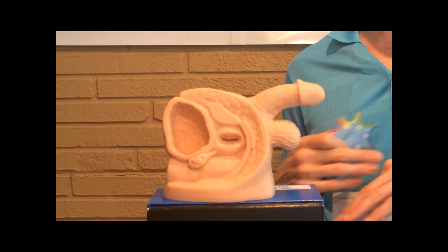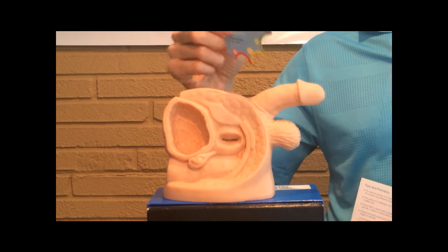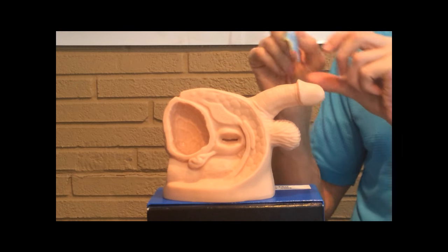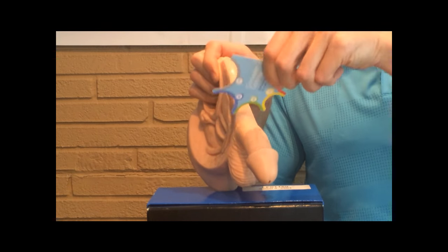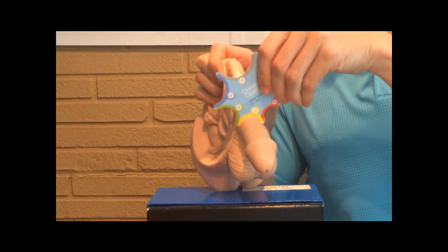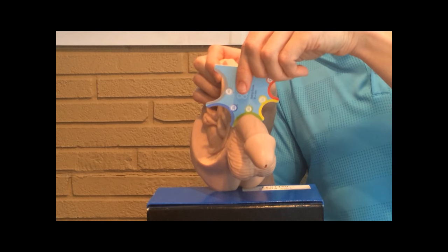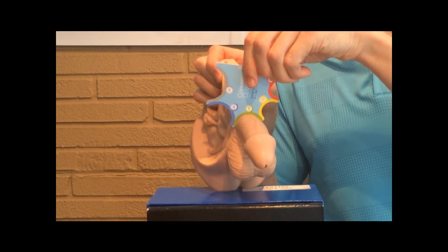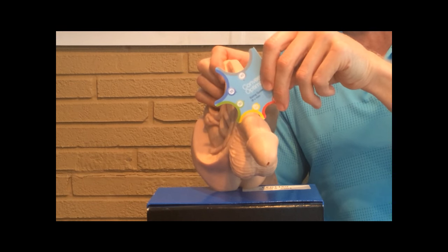If you use the wrong size, you can have major problems and you do not want to have an accident. This is a measuring guide for the Conveen Optima, and you want to put it on the widest part of the non-erect penis to figure out the best fit. The 30 looks good, 35 is a little too big, 25 is not quite right, so 30 is the best fit. If you find you're in-between sizes — say 25 is a little too small but 30 is a little too big — do not go with the bigger one; go with the slightly smaller one. It's made of silicone, it's expandable, so don't worry about it being a little snug.